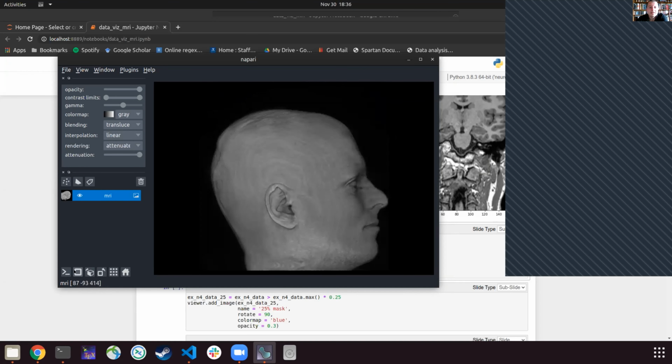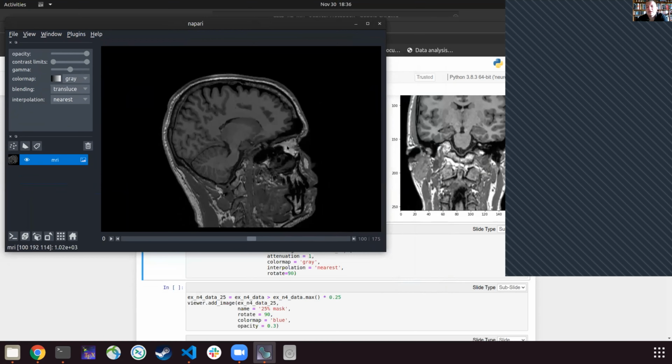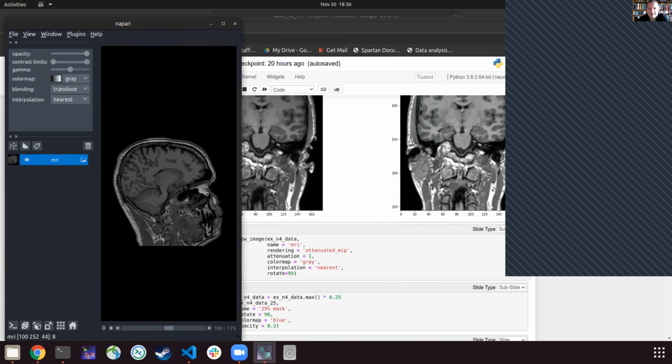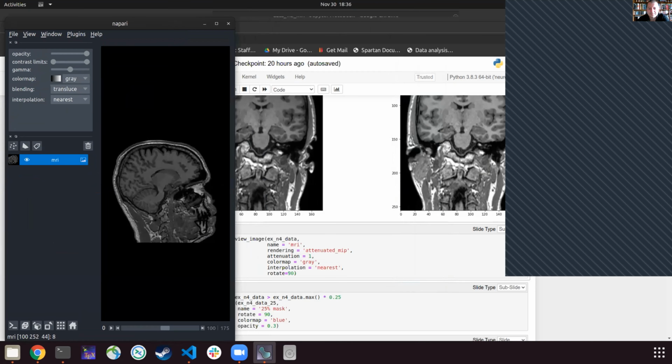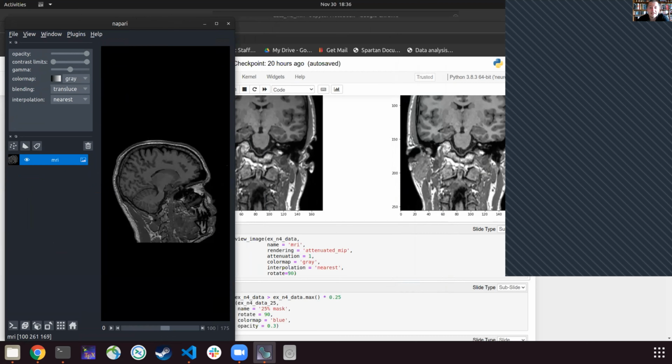All right. So we're really quite interested in looking at changes that happen in the brain, for example, and diagnosing pathologies that occur in the brain itself. You know, sometimes it might be interesting to look at, say, the cheek, but for example, with stroke, we're not really interested in what's going on in the cheek, we're interested in what's going on in the brain.